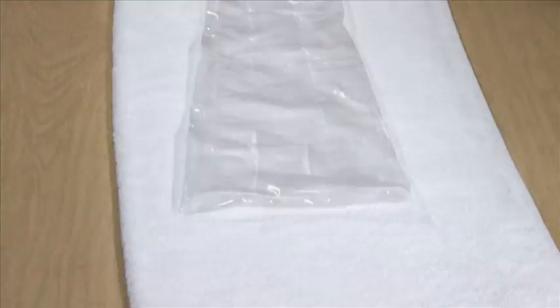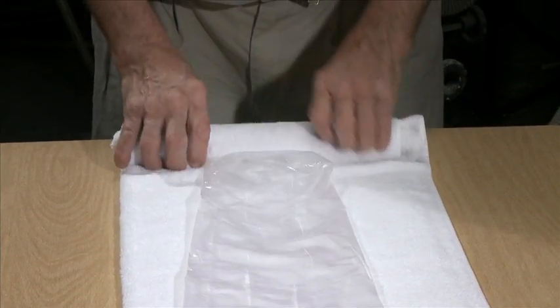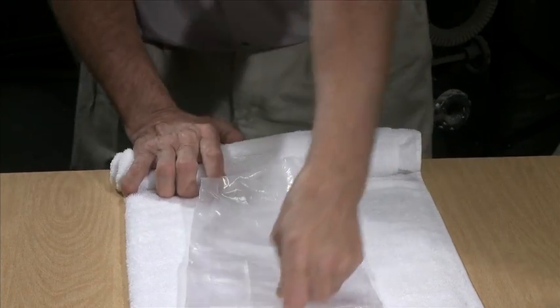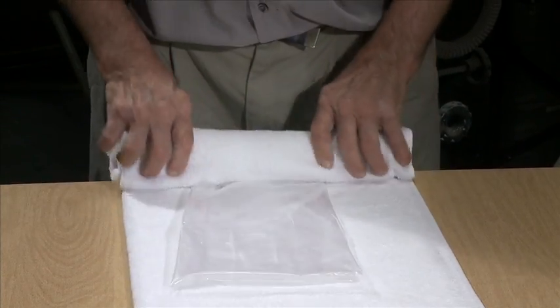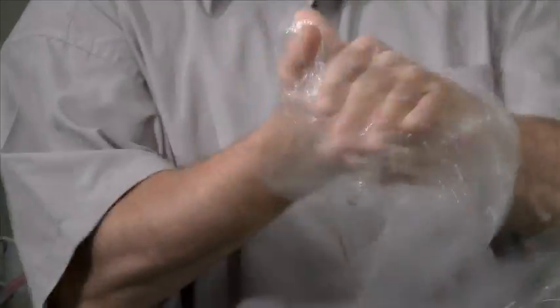Now, moisten the bag by rolling it in a damp towel. Wetting the bag more than normal can make it more elastic for a better fit. Next, work the bag with your hands to soften it.